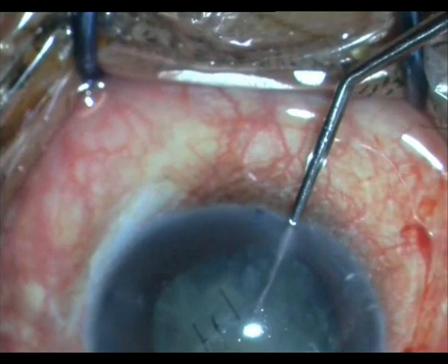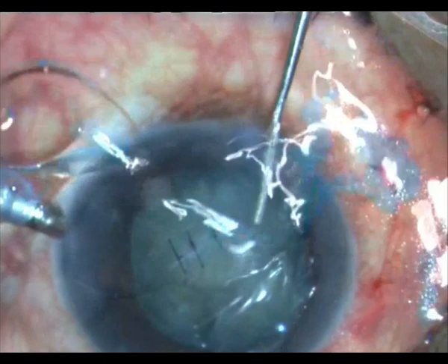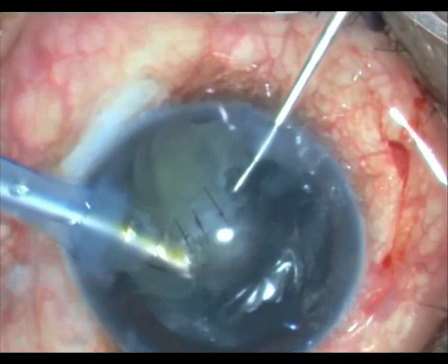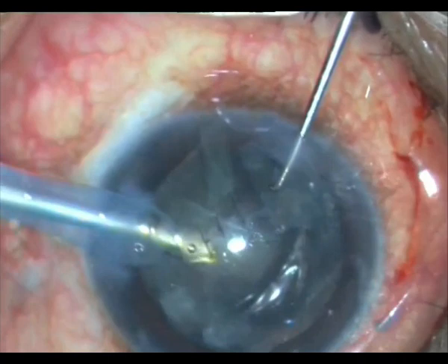I know it has been separated enough — nothing for me to worry about. I take a Sinski hook in one hand and my FACO probe, and the moment I hit vacuum, just see what happens — very neatly, it almost FACO-aspirates. I am hardly using any FACO power.